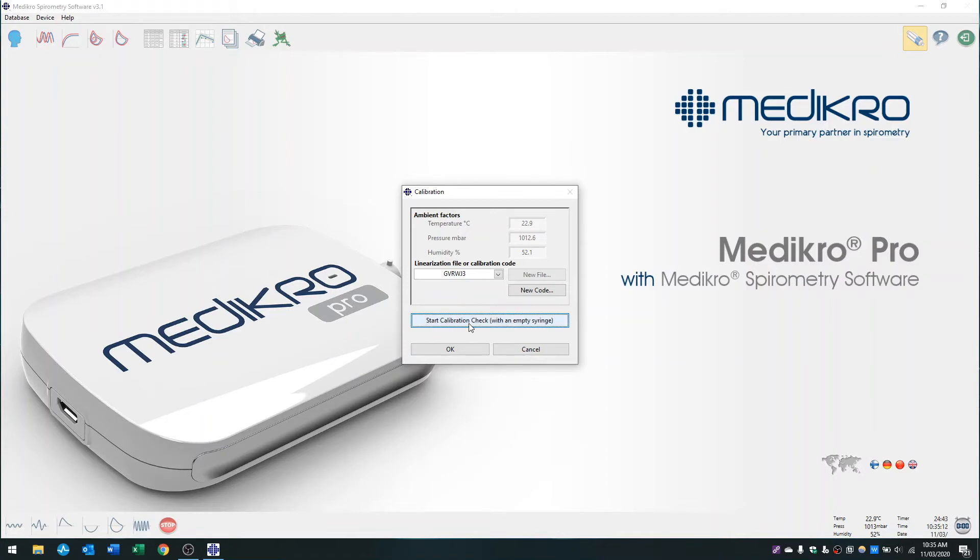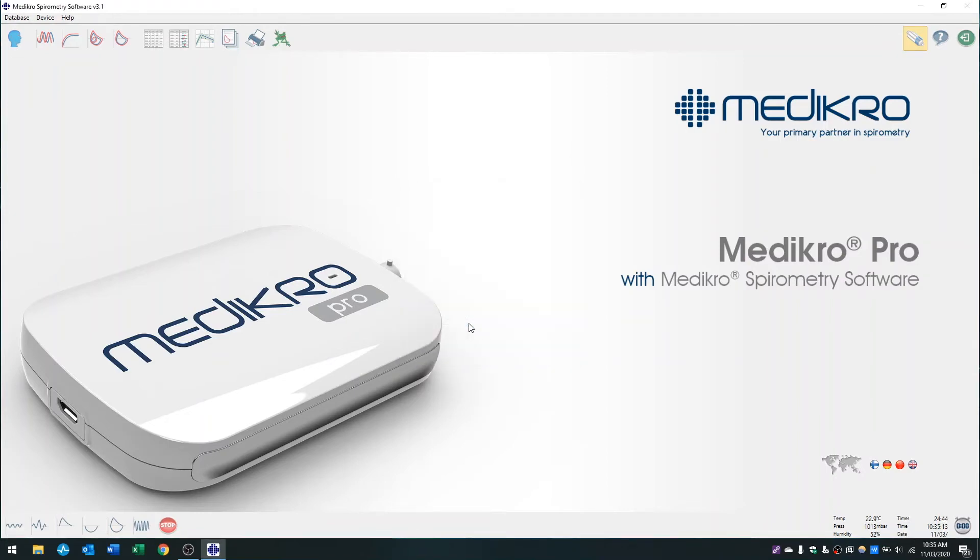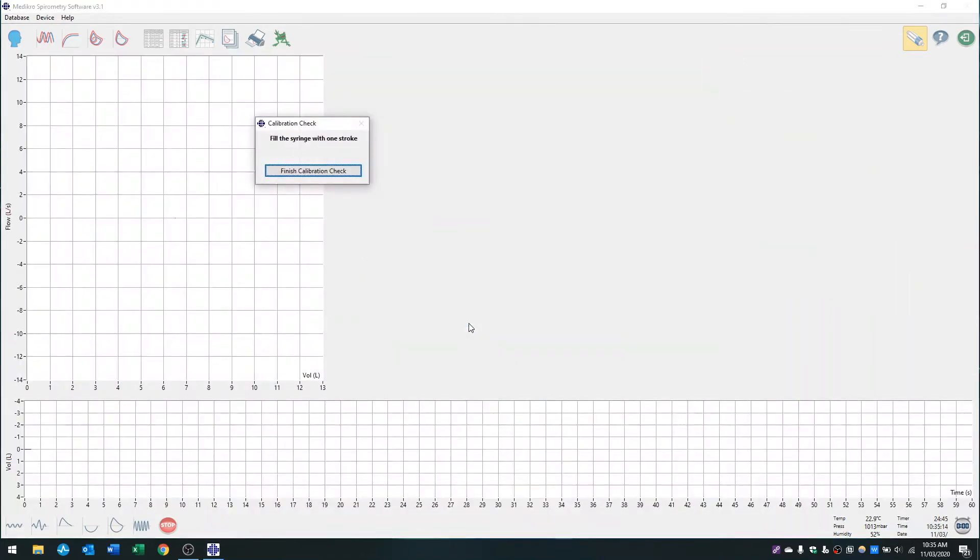I'll press start calibration check. I've got my syringe ready and I'm just following the instructions on the screen. It says fill the syringe with one stroke.